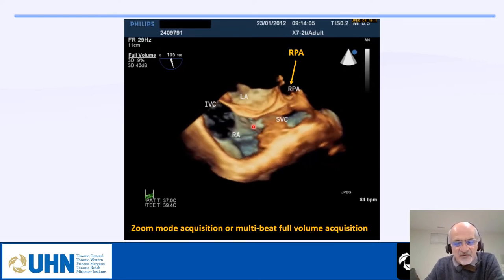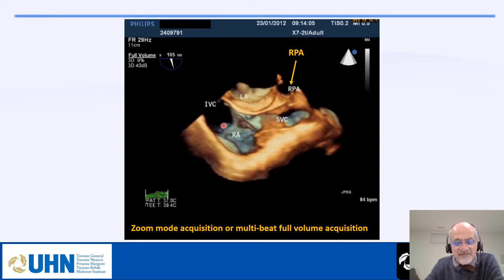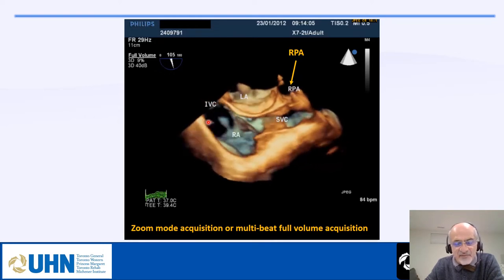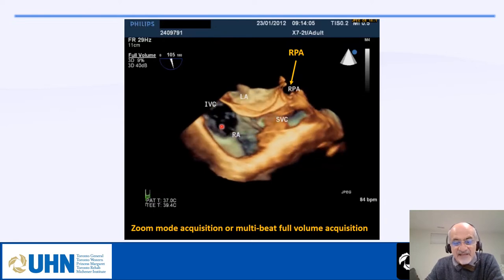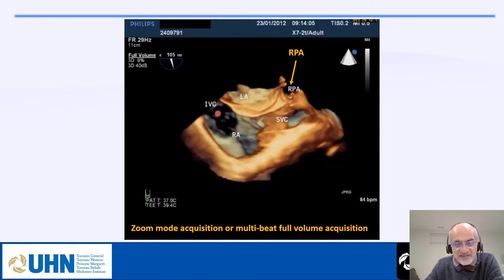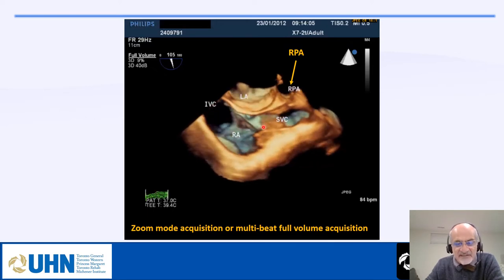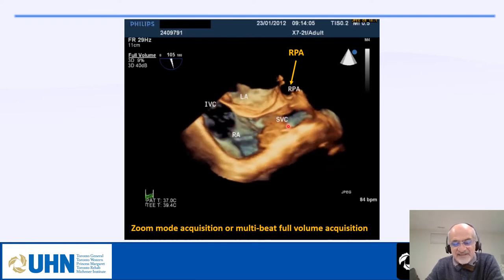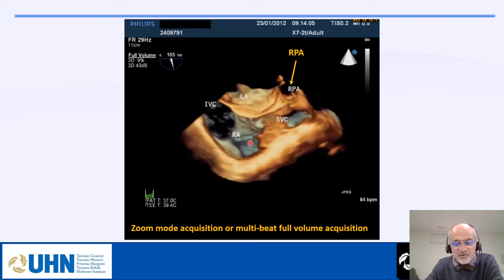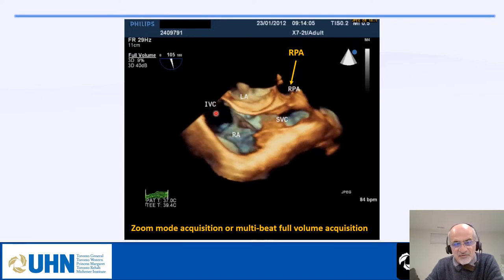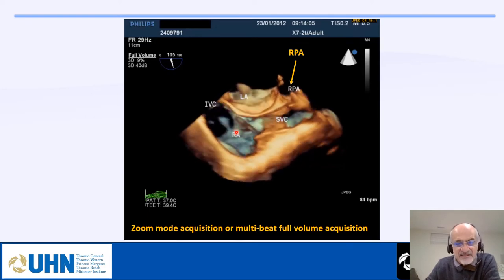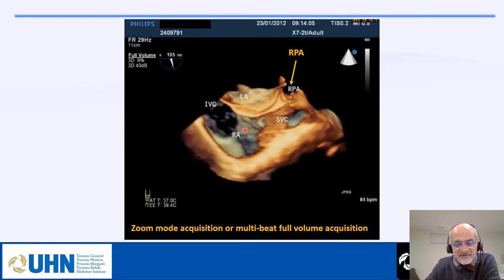In the bicaval view during 3D, if you have an ASD in this area, you might not see the IVC rim properly — this doesn't mean the rim is absent, you just can't see it because the IVC is more posterior. This is why many interventionalists prefer intracardiac echo to guide ASD intervention, since it allows better visualization of the IVC.